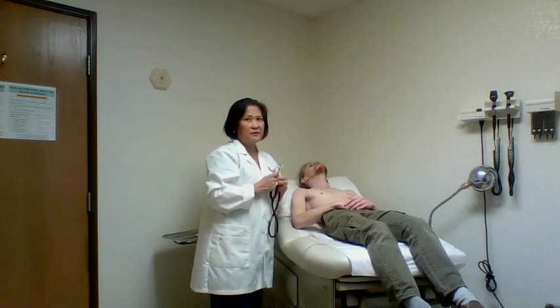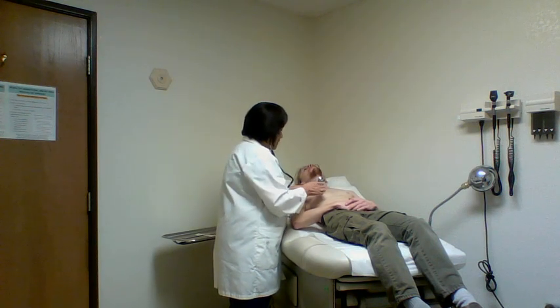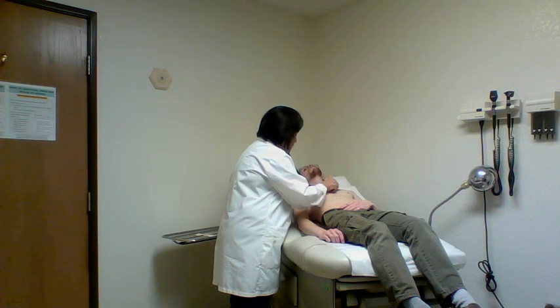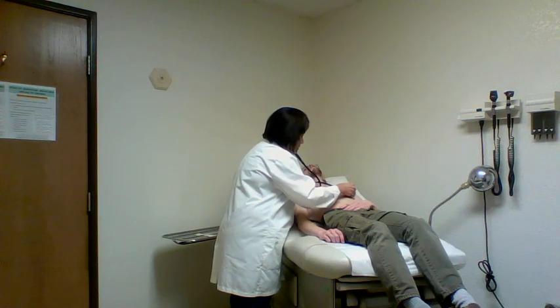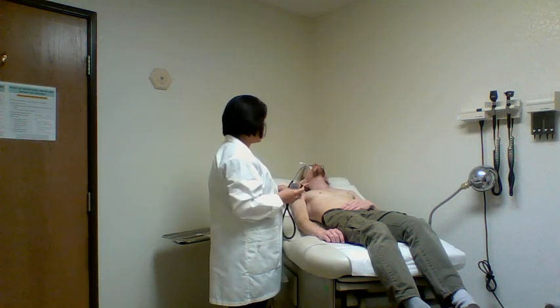Okay? So, to auscultate, we'll use both the bell and the diaphragm. Again, on the second intercostal, the right side of the sternum. On the second intercostal, the left side, and then the third, the fourth, the fifth, and mid-clavicular. So here we will note for any murmurs, any splitting, which I do not hear with JH.